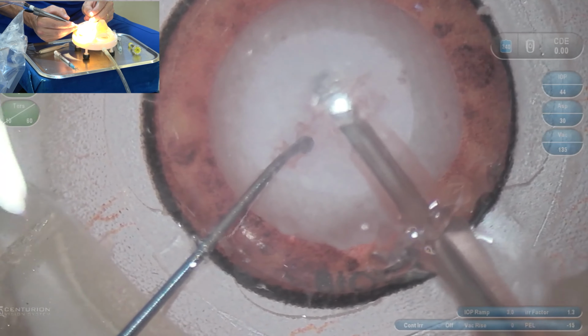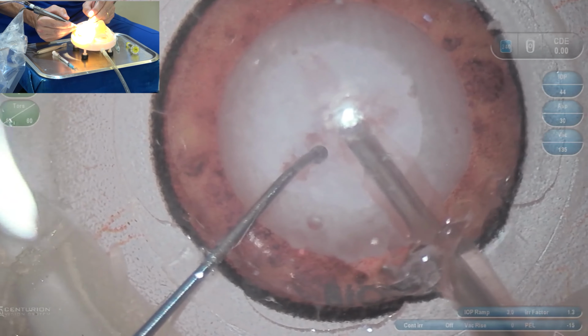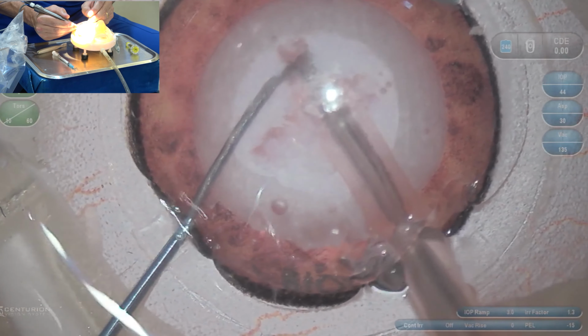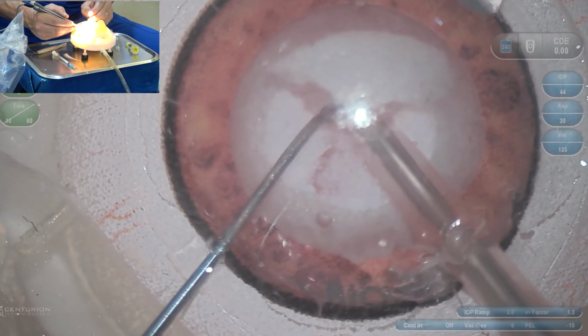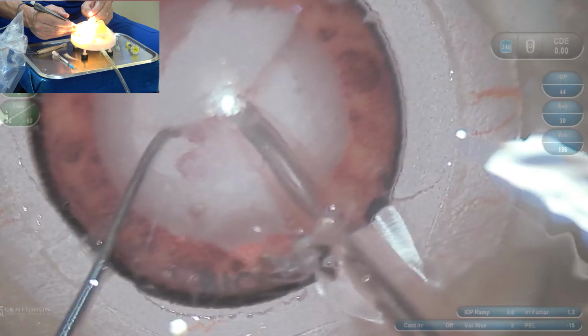Look at that. The important thing is you only deliver ultrasound when the tip is occluded. Okay, so I have it occluded. Look at that. You can also hear the longitudinal ultrasound because this is a very, very, very hard cataract, and we did it perfectly. Now we have the small fragments.